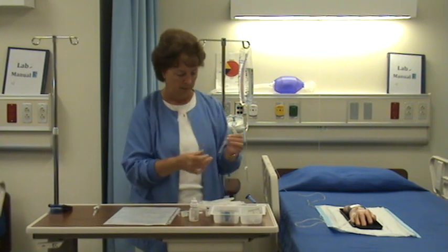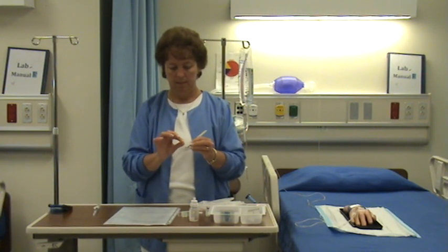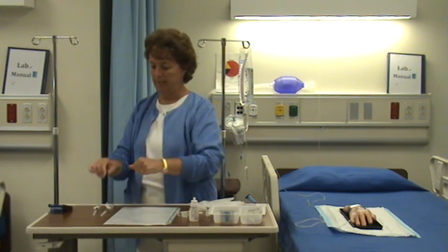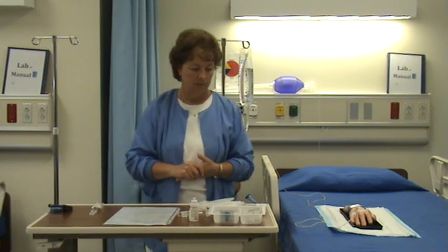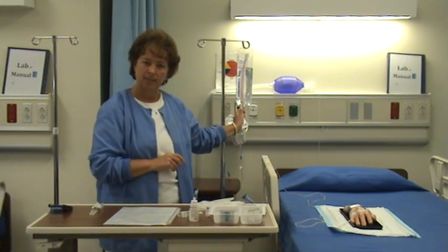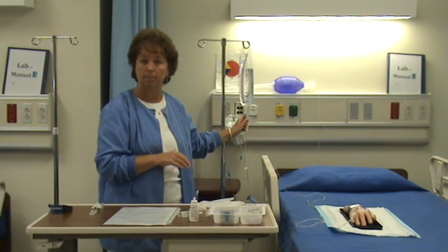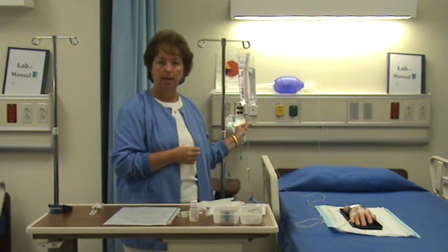Okay. And then I'm going to mark that Lasix. So now I have my Lasix, IV push medication, and then my normal saline post-flush. What's running in the IV, I don't know if I said this yet, is normal saline. So if it was something different, you might have to check compatibility, but we know that medications are compatible with normal saline.